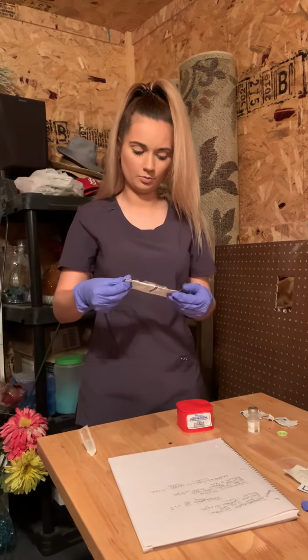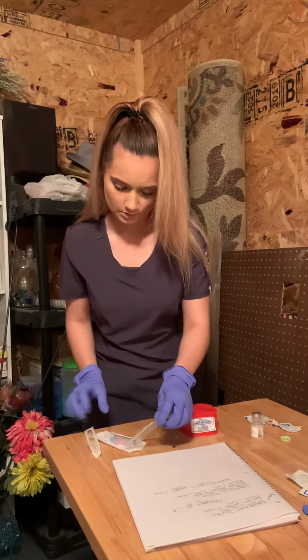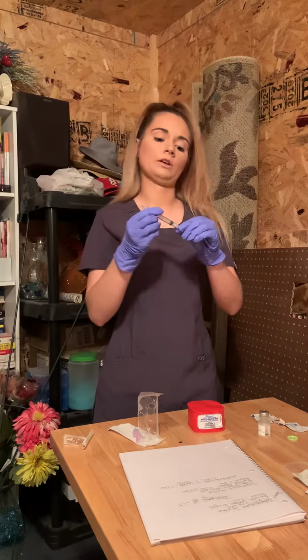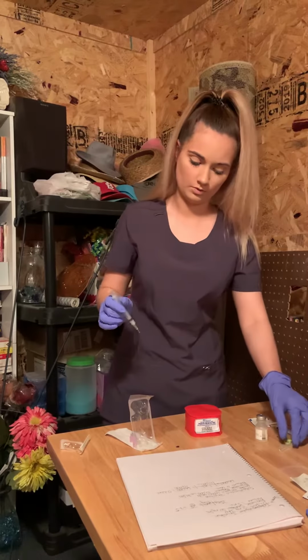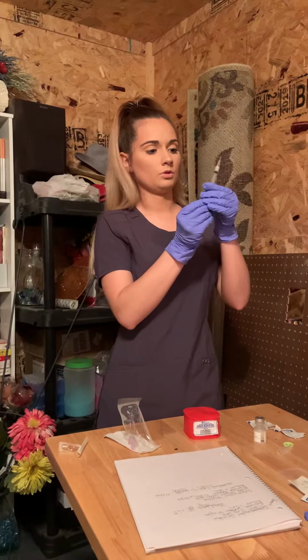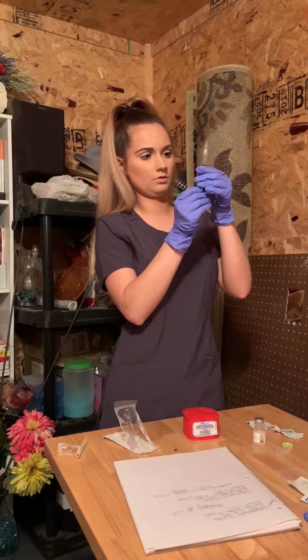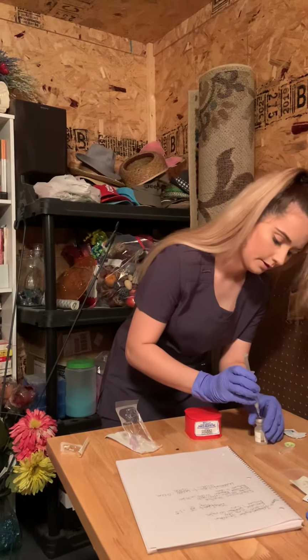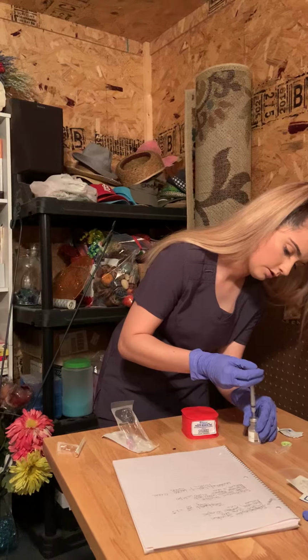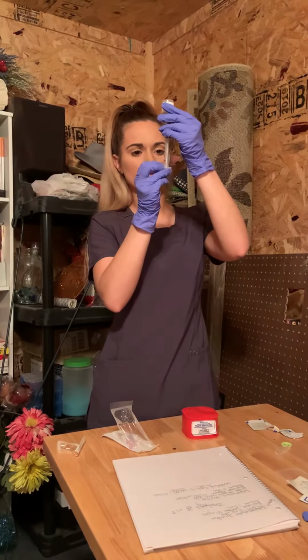For this injection, we will be using a blunt needle to get the medication out of the vial. So I'll put the blunt tip on. The reason we have a blunt tip is so the needle does not get dull when you poke it into the vial. And you will want to pull the syringe out, make sure you get the right dosage you need. Insert the tip into the vial and inject the air. You will flip it upside down and get your medication.